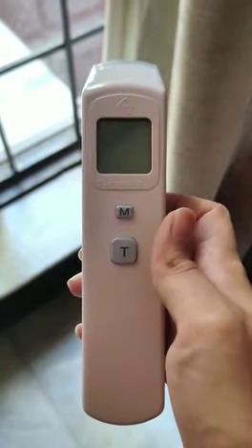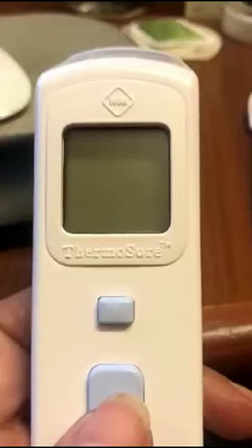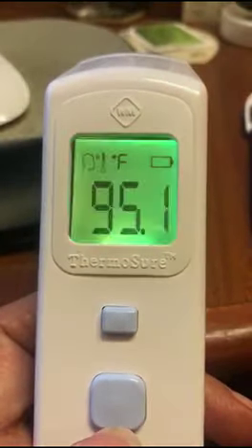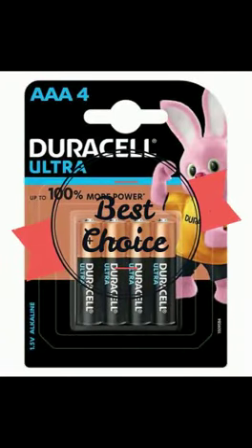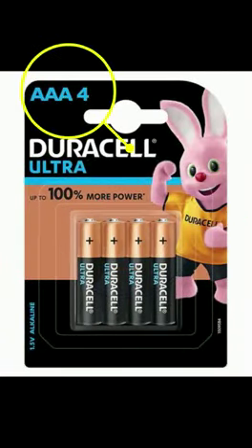If you encounter any of these, it means that your battery is totally drained out. In this case, we recommend you switch to Duracell Alkaline AAA batteries, which will give you 6 to 10 months of usage.